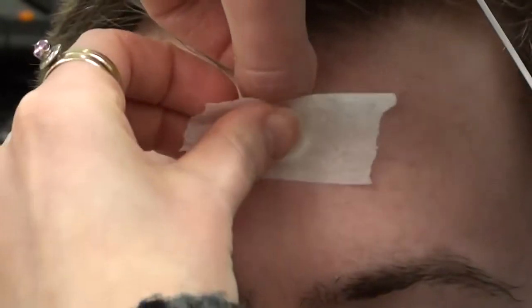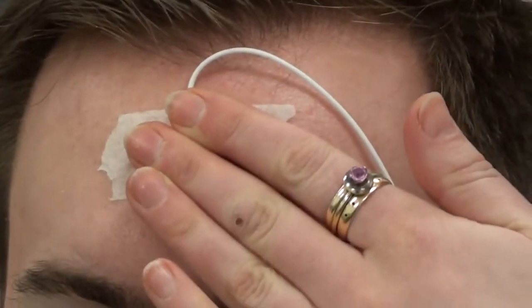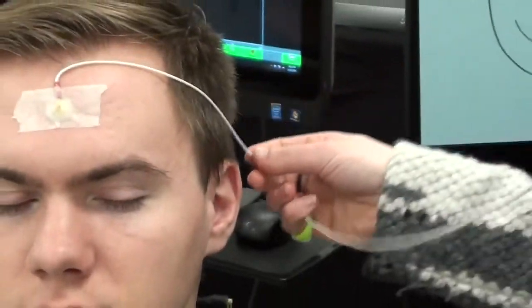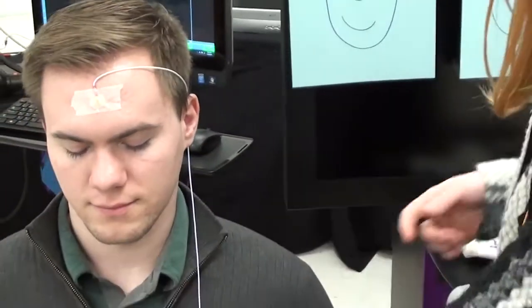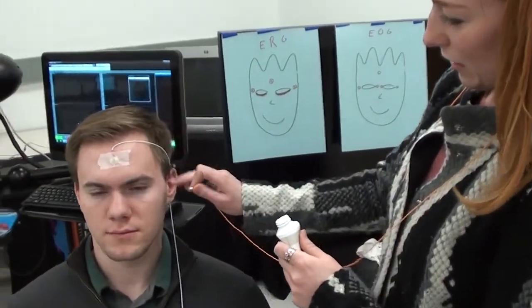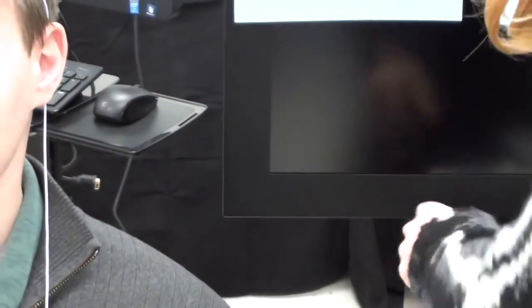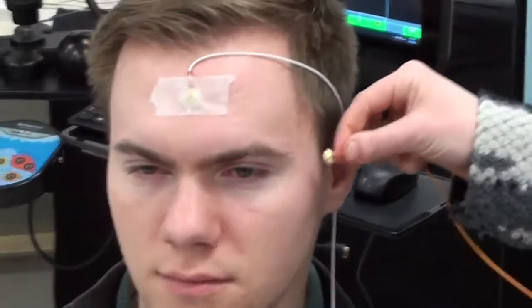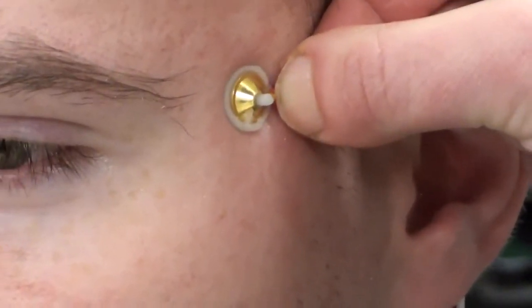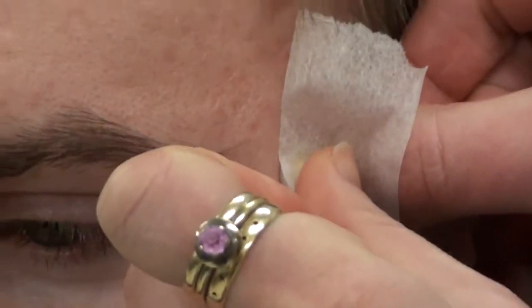Pushing firmly so that the conductive paste comes out from the sides and top, take the tape and push it into place. You can use your fingers to press down firmly on the electrode, tucking the wire behind the ear. The same process applies for the side electrode — place it, press it, and tape it down.